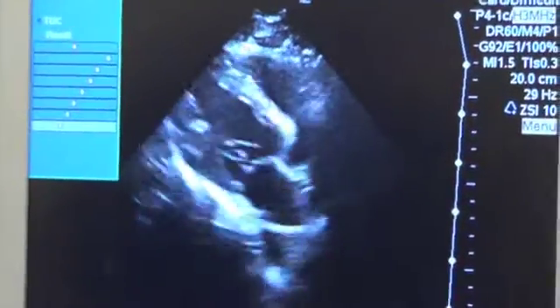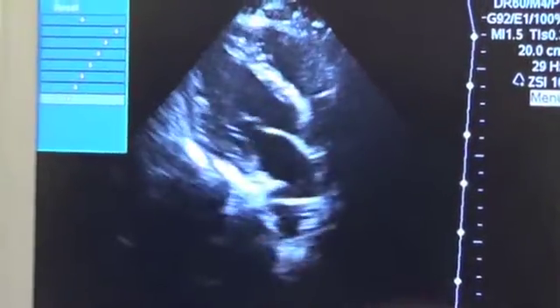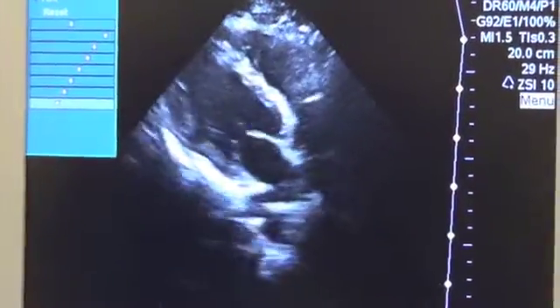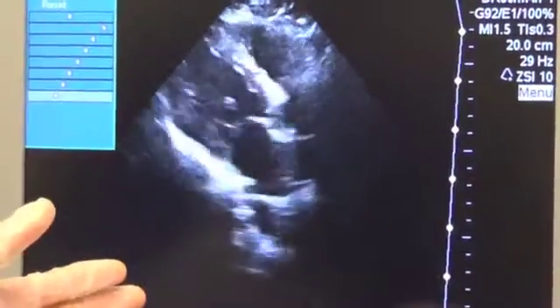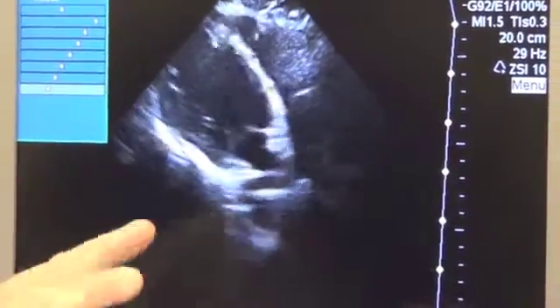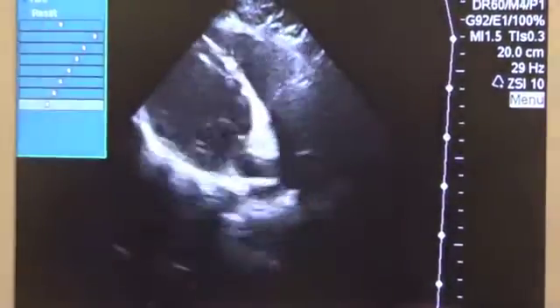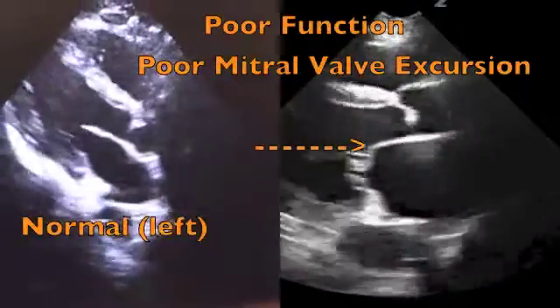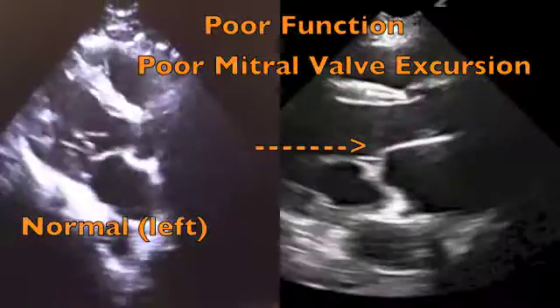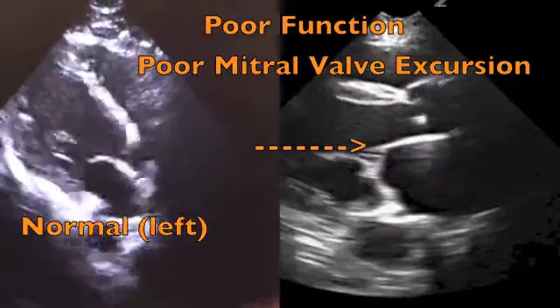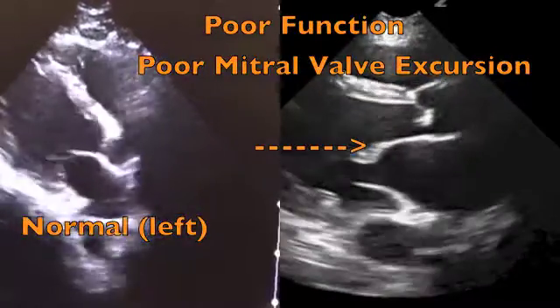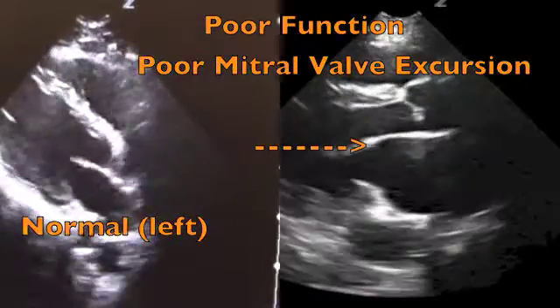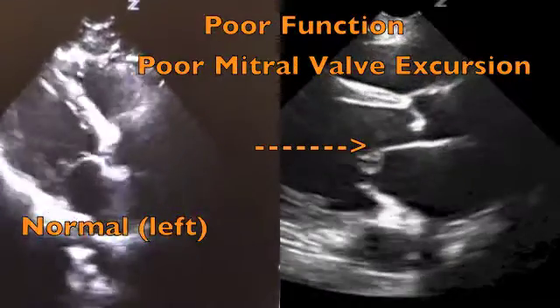There are four components that we will evaluate to determine left ventricular systolic function. The first and easiest thing to look at is mitral valve opening. We want to ensure that the mitral valve opens fast and wide, as it does in this case. Every time there's mitral valve opening it comes all the way against the septum, almost touching it.